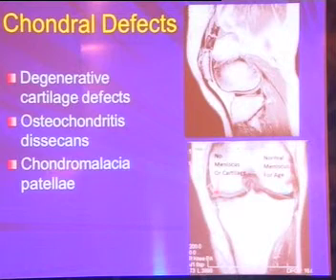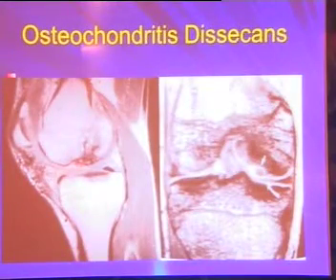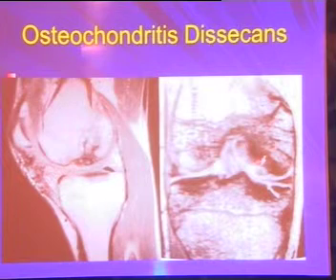Lateral collaterals are difficult to see here, so you have to appreciate them on different cuts. With contrast like this, the normal condyle is surrounded by fluid, and that is a sign of effusion.